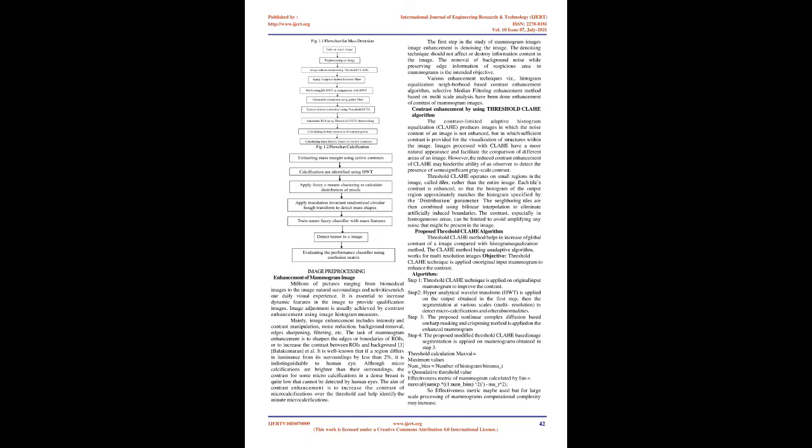Multi-scale wavelet representation suggests a mathematically coherent basis not only for existing multi-grid techniques but also for exploiting nonlinear systems. Multi-resolution wavelet analysis provides a natural hierarchy in which the embedded program provides an interactive paradigm for accomplishing scale-space feature analysis. The generalized wavelet transformation algorithms proposed by Ebrahim Jelvefard, Shradhananda, based on 2D DWT, have poor directionality, shift variance, and absence of phase information, which are serious drawbacks to making a reliable or appropriate tool for the radiologist.